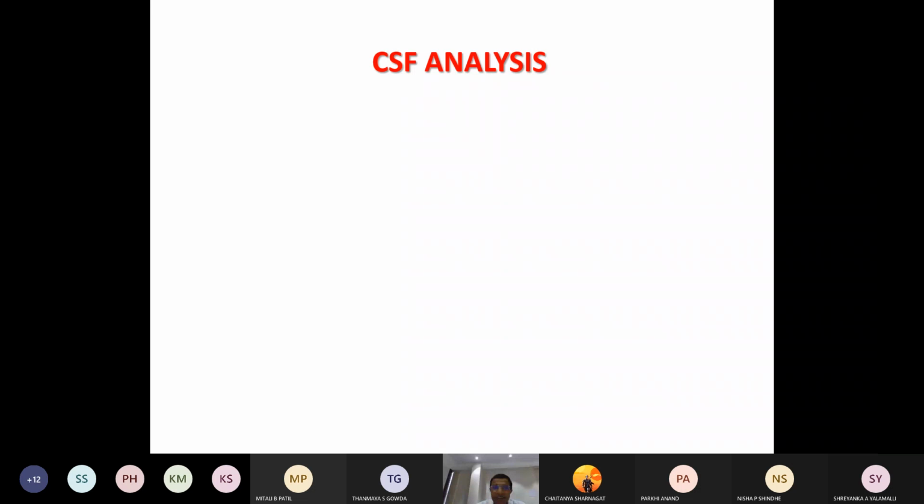Okay. Anyhow, today we'll have a CSF analysis demonstration. Actually, it's a tomorrow class. Tomorrow, Walvekar sir will take his class, a little exchange because he's on leave. You can go through the importance of CSF, cerebrospinal fluid analysis.